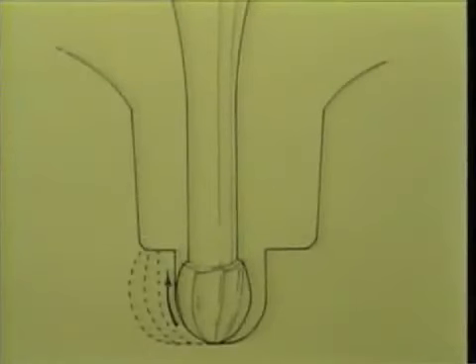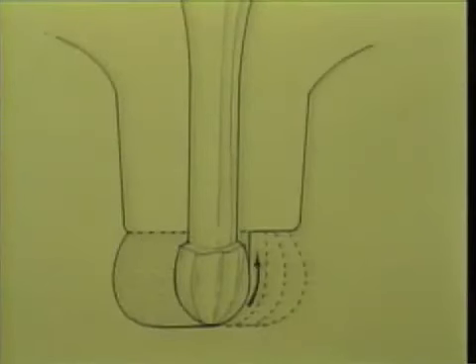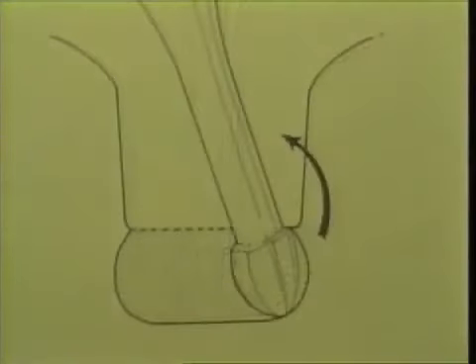With the handpiece running at high speed, the burr is reseated into the established cervical extension of the initial penetration and contacting this area of the tooth structure without cutting cervically. The burr is moved in a buccal direction, approximately 1/2 a burr width at a time, and then withdrawn. This procedure is repeated 2 or 3 times until proper extension is accomplished. After completing the buccal extension, the number 2 burr is placed into the original point and depth of penetration. The identical movements used for the buccal extension are now followed until the desired lingual extension is completed.